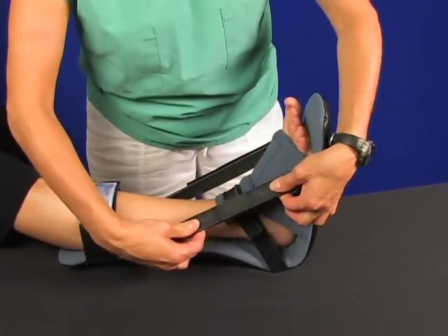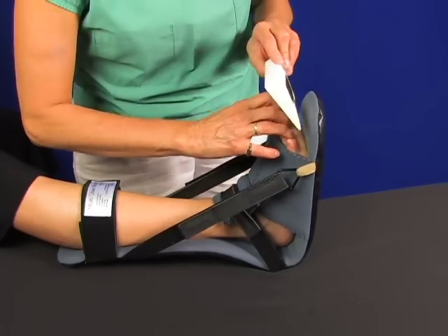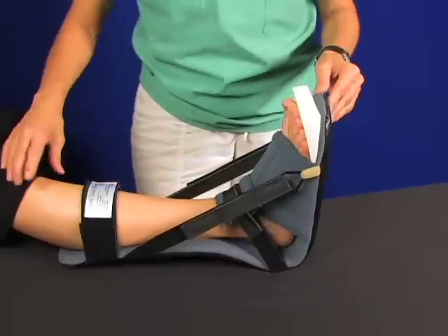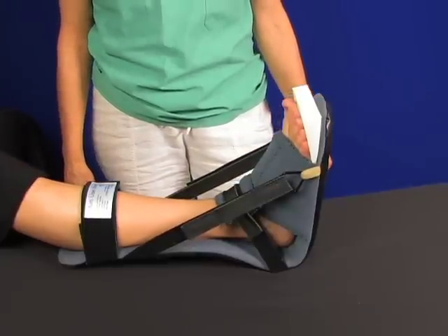Finally, if the use of the toe wedge is desired, lift up the toes and slide the white foam wedge under the toes. This provides one last additional stretch to the plantar fascia.